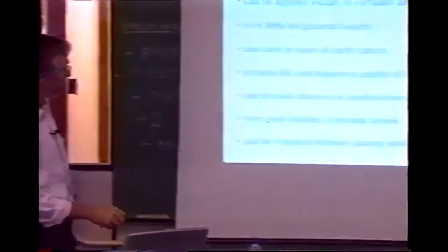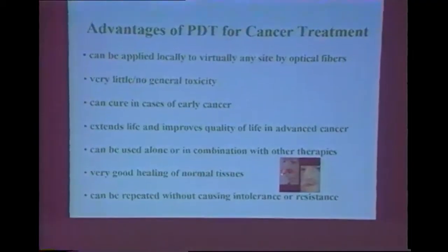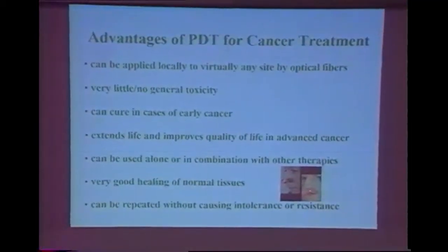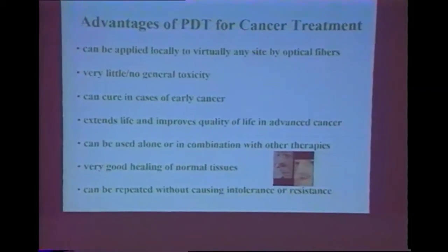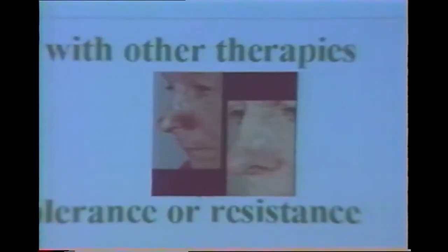This is an example of the nice healing. So here's a tumor on the nose, treated with PDT. You see afterwards a very nice preservation, and that's because this is non-thermal, and so there's no destruction of the architecture of the tissue.